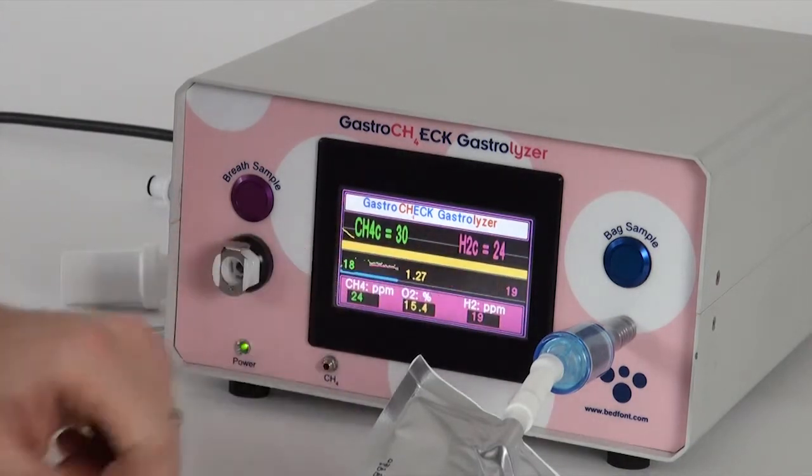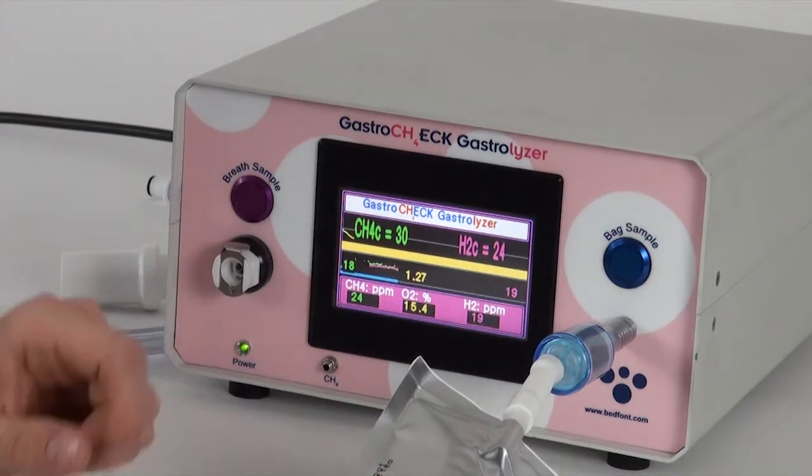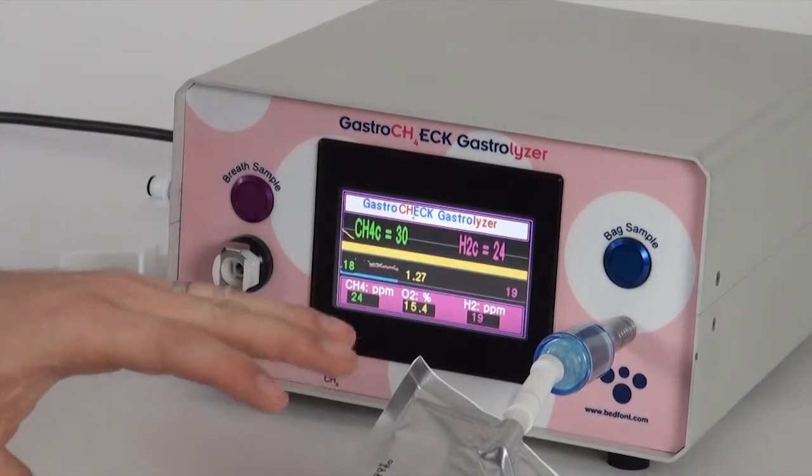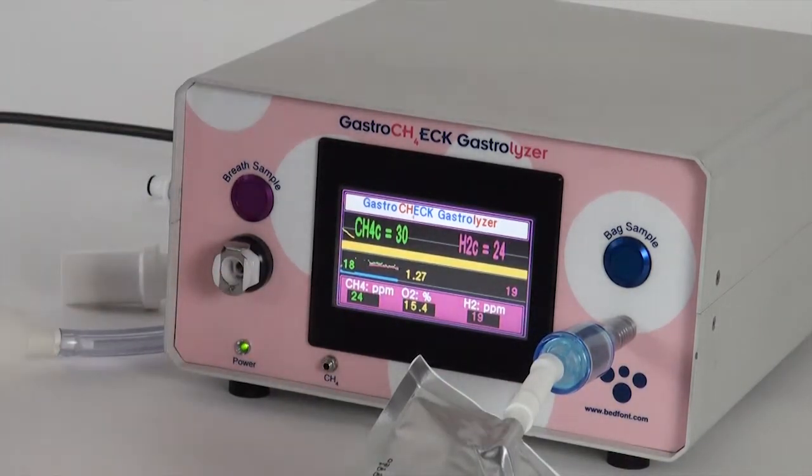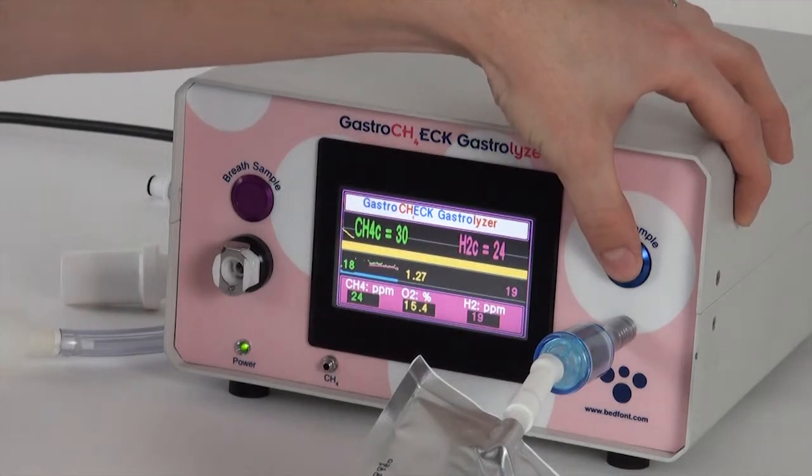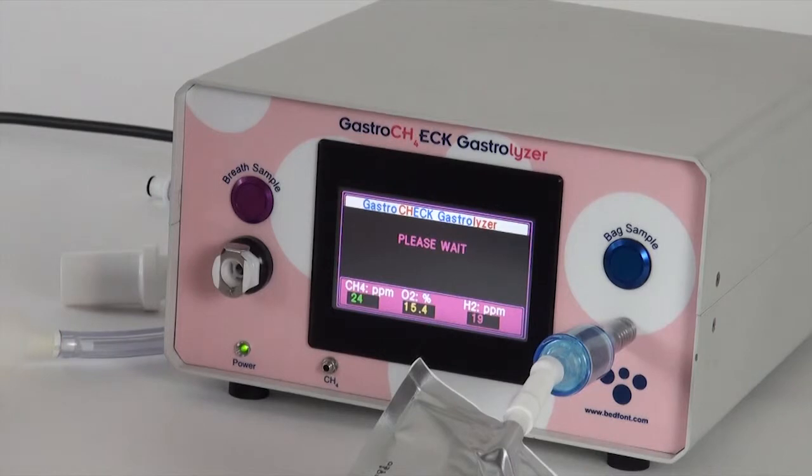So it now uses the correction factor, changes that 1.27 correction, and then gives us the 30 on the CH4 and 24 on the hydrogen, which is again relatively close to the reading we had in the first place. But because there's more oxygen in the bag, it needs to do a bit more calculation. And to stop that sample, you just press the button on the screen and it restarts it again. And that's how to do a breath test.